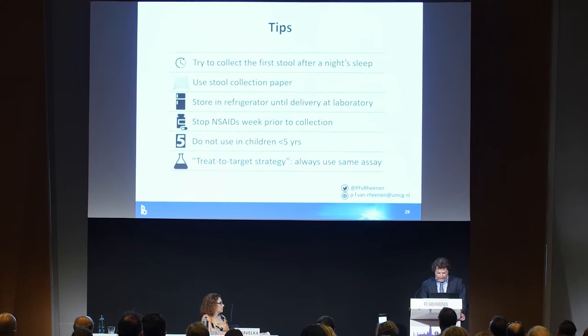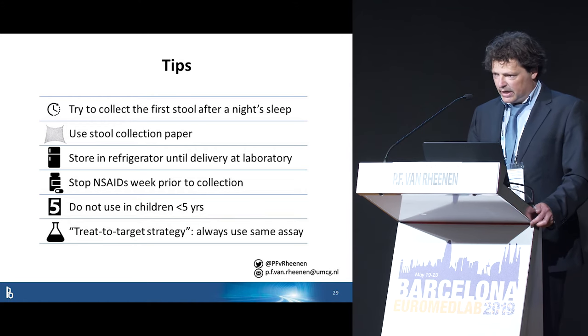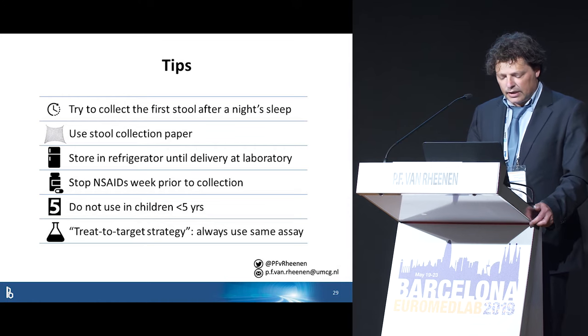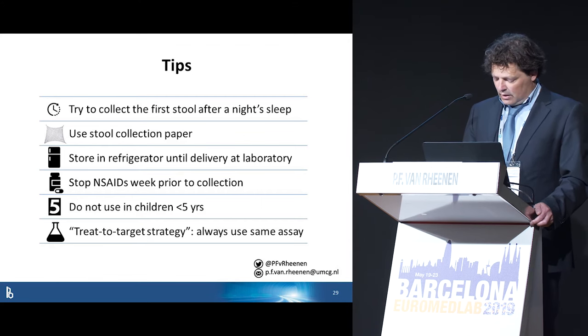So I want to end my talk by giving some tips. The first one is to try to advise the patient to collect the first stool after a night's sleep. But unfortunately, it's not urine, and a patient does not have so much control over the moment of opening bowels. Secondly, the use of a stool collection paper is advisable, because then it's not mixed with the flushing water of the toilet. And it's good to store the stool in a refrigerator until it is delivered at the laboratory, because there is some degradation of the protein at room temperature.